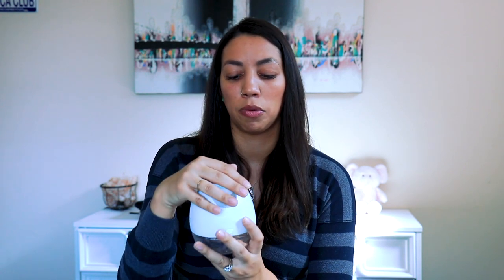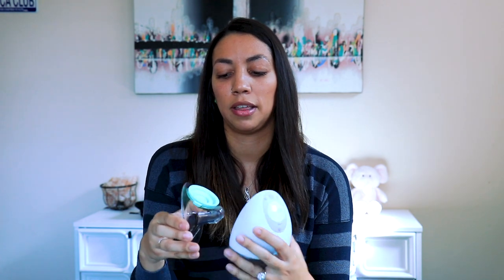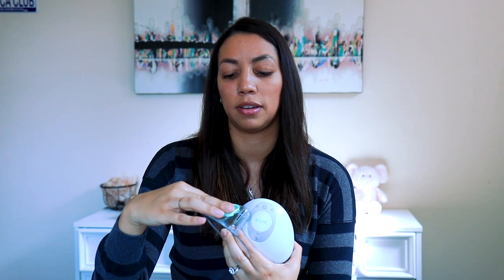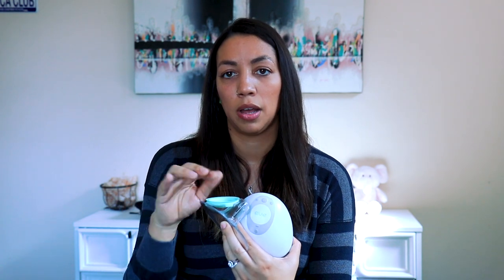I take it out of the bra and push it together a little snugger. If the suction still isn't perfect, I take this piece off and make sure it isn't off-kilter — because it's removable it can slide around. Just make sure it's on really straight and snap it back in there.